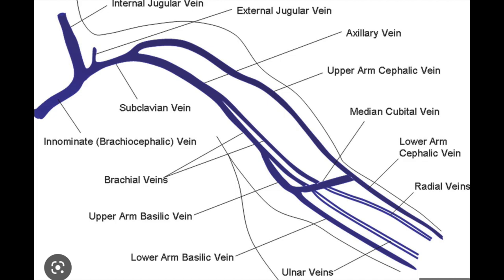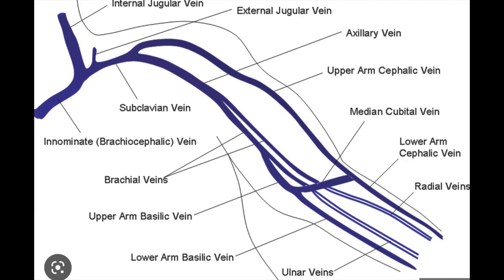The deep veins include the subclavian and the internal jugular. They have characteristic waveforms which we will be subsequently seeing.